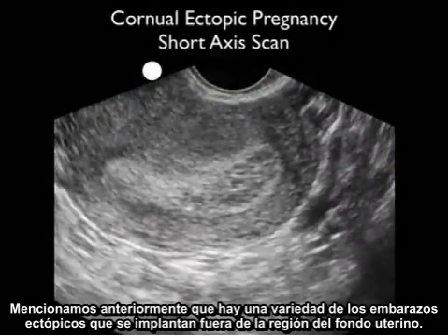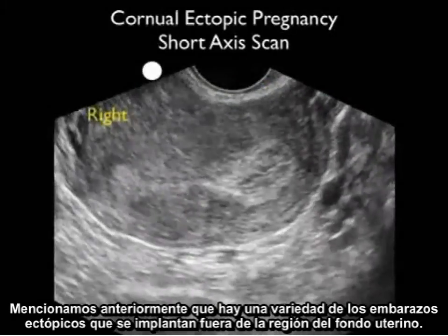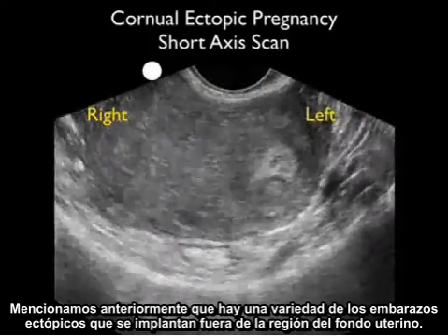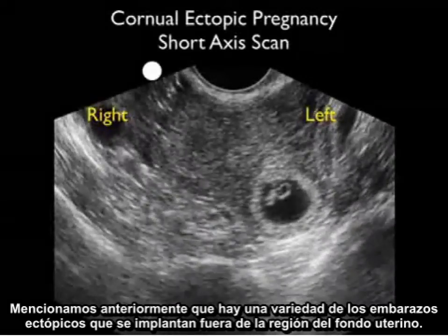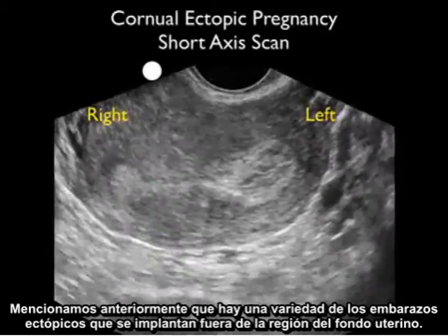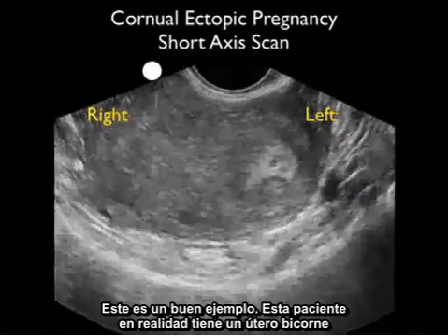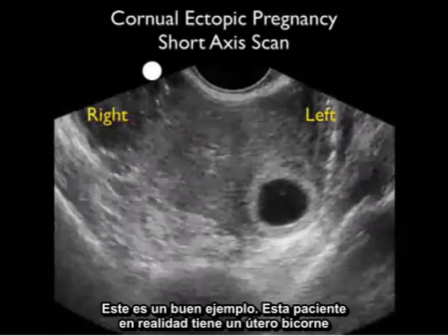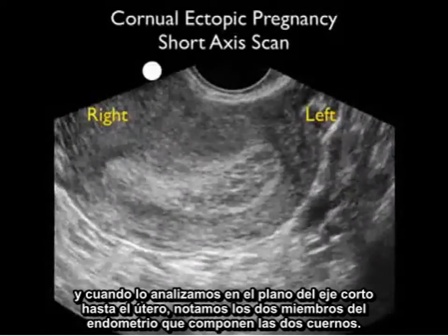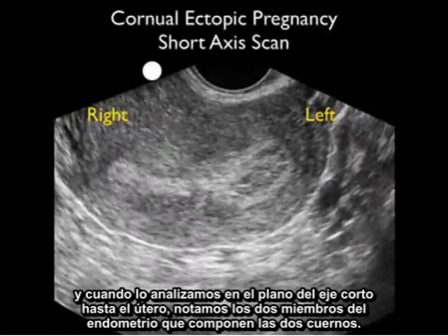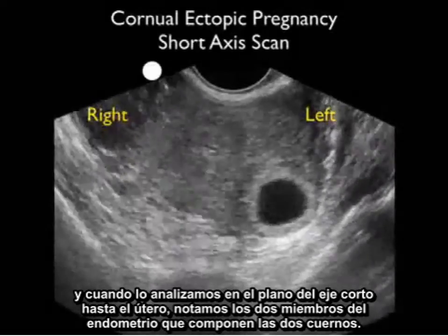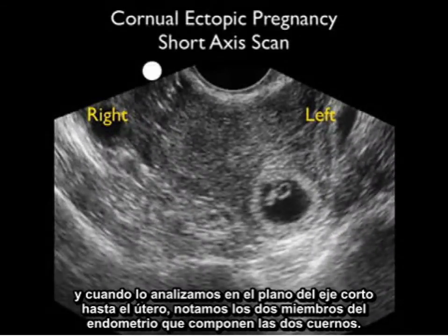We mentioned earlier that there are variants of ectopic pregnancies that implant outside the fundal region of the uterus in an aberrant location. This patient actually has a bicornuate uterus, and as we scan in a short axis plane up the uterus, we notice the two limbs of endometrium that make up the two distinct cornua.